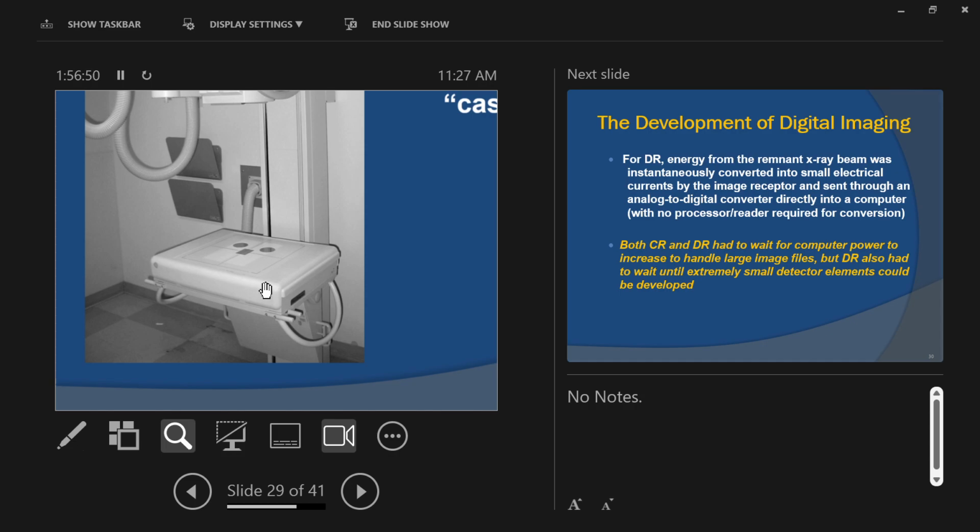You're getting it done. If you ever get a chance to move on and be an RT and work in a hospital, you'll do mobile radiography. And in mobile radiography, there's no X-ray room, right? There's a patient in a hospital bed, and you have your X-ray machine that rolls around. You can put it wherever you want, and you've got a cassette, right? And it's all done right there. No X-ray room, nothing. You have to improvise everything.